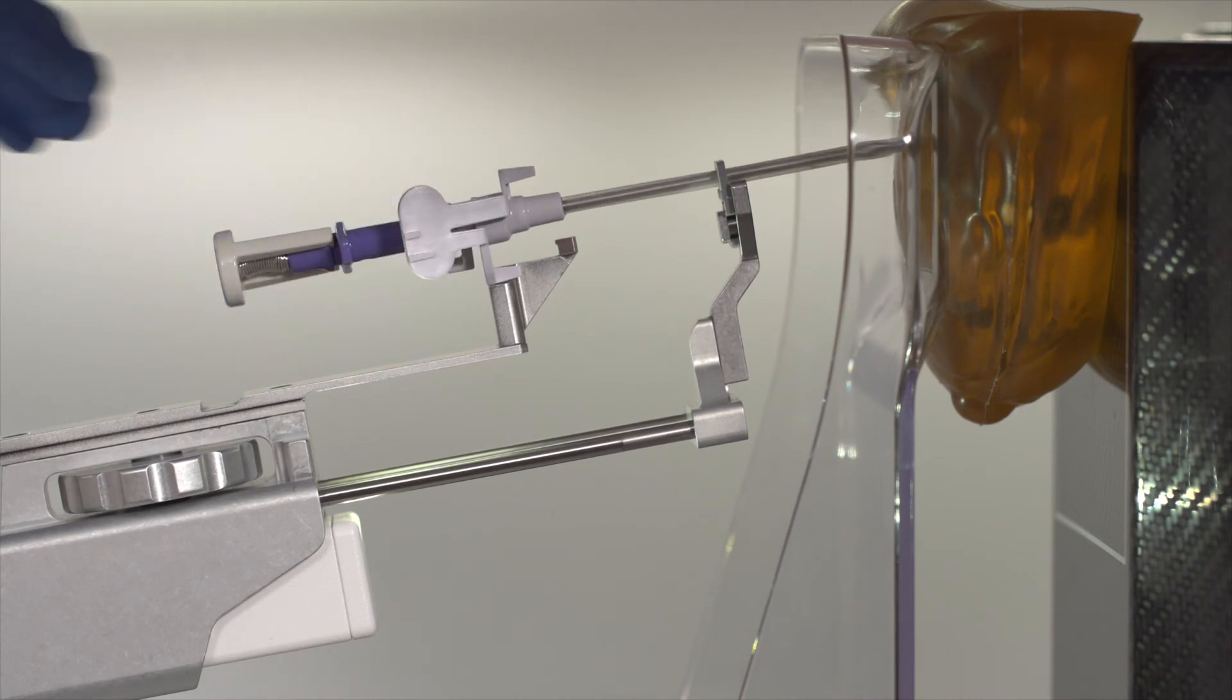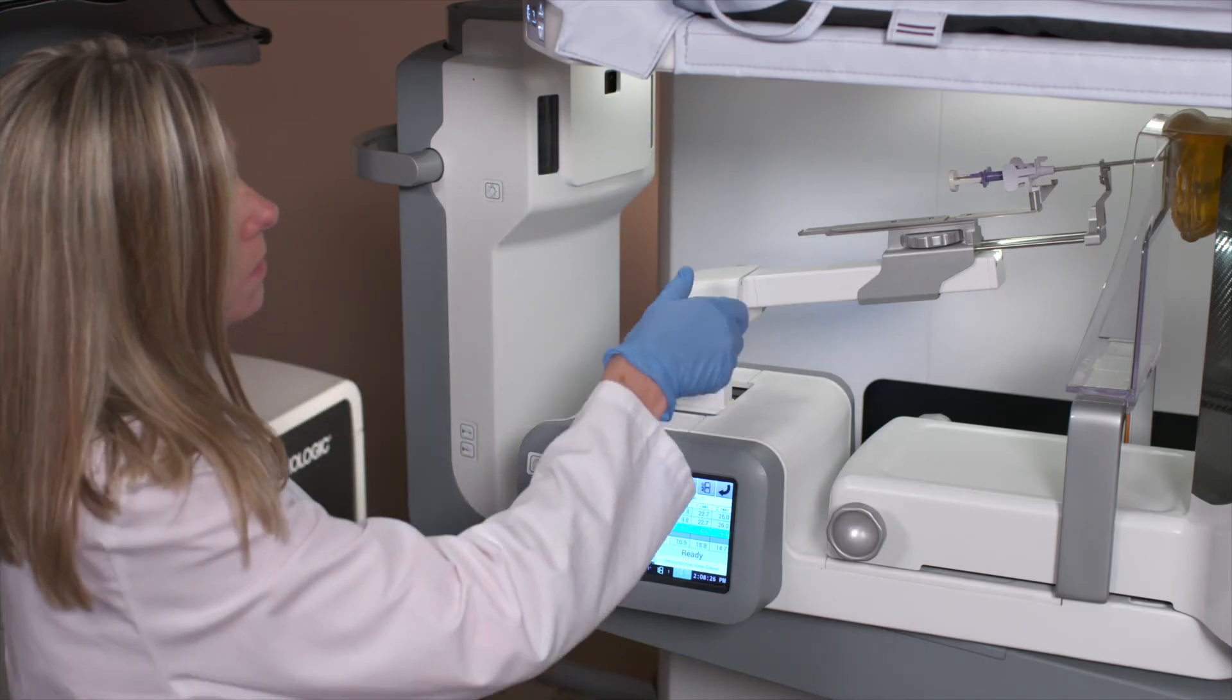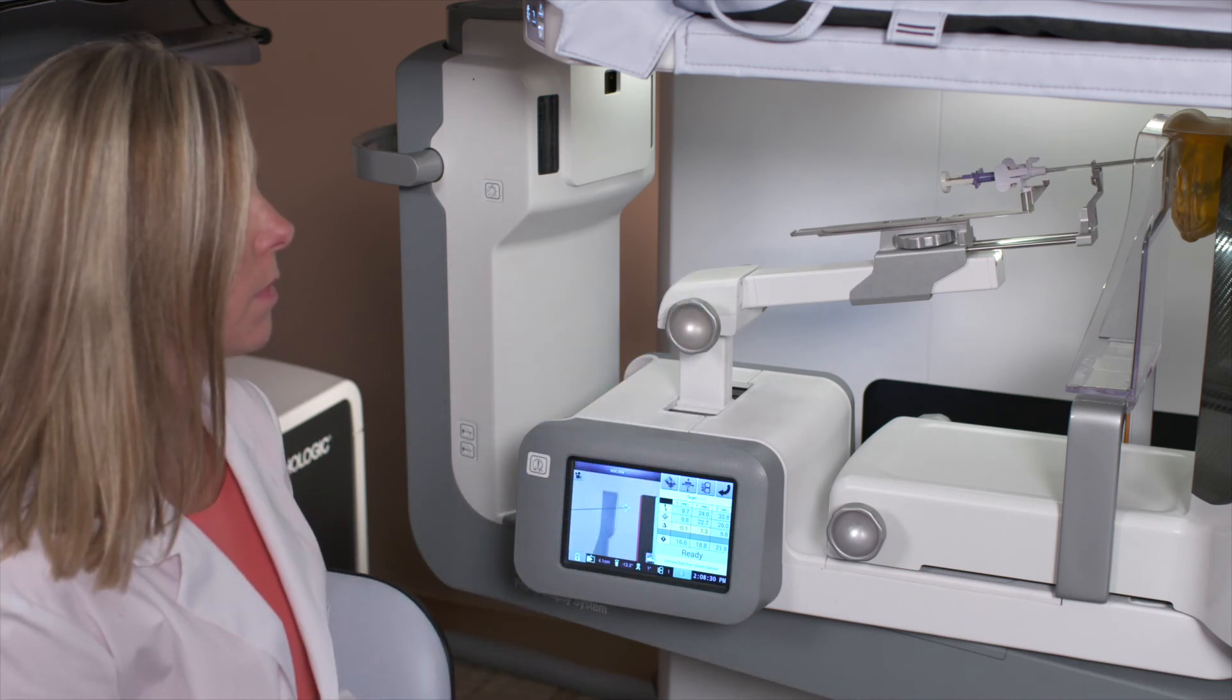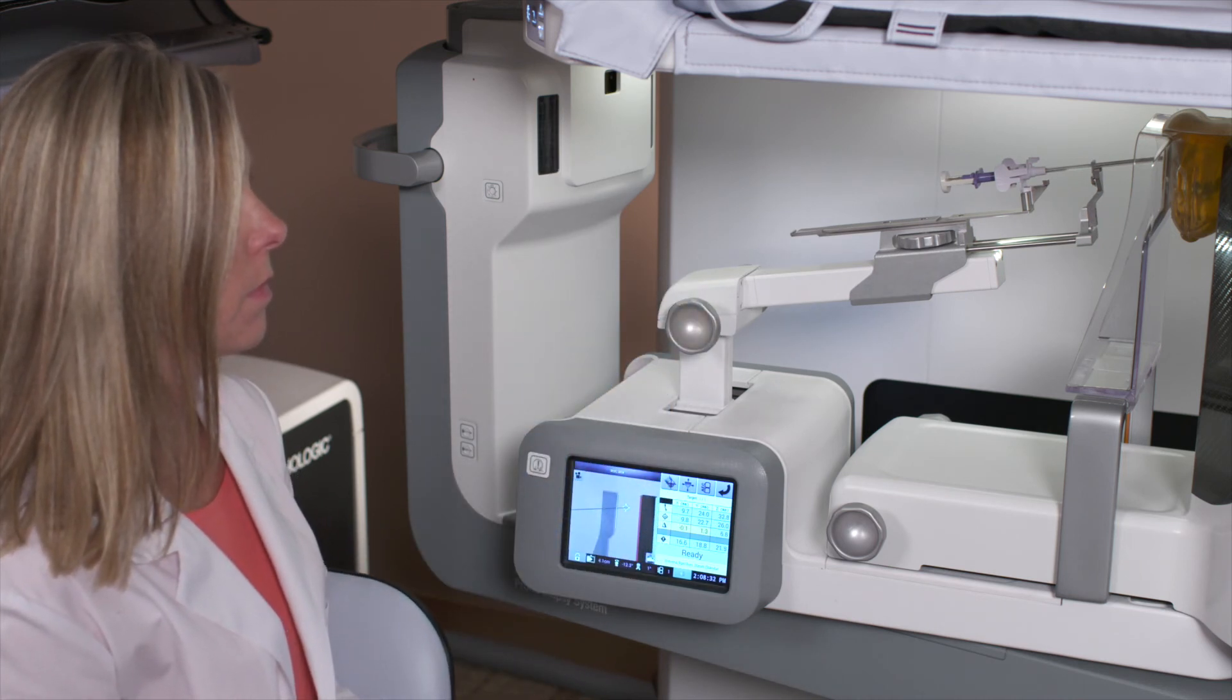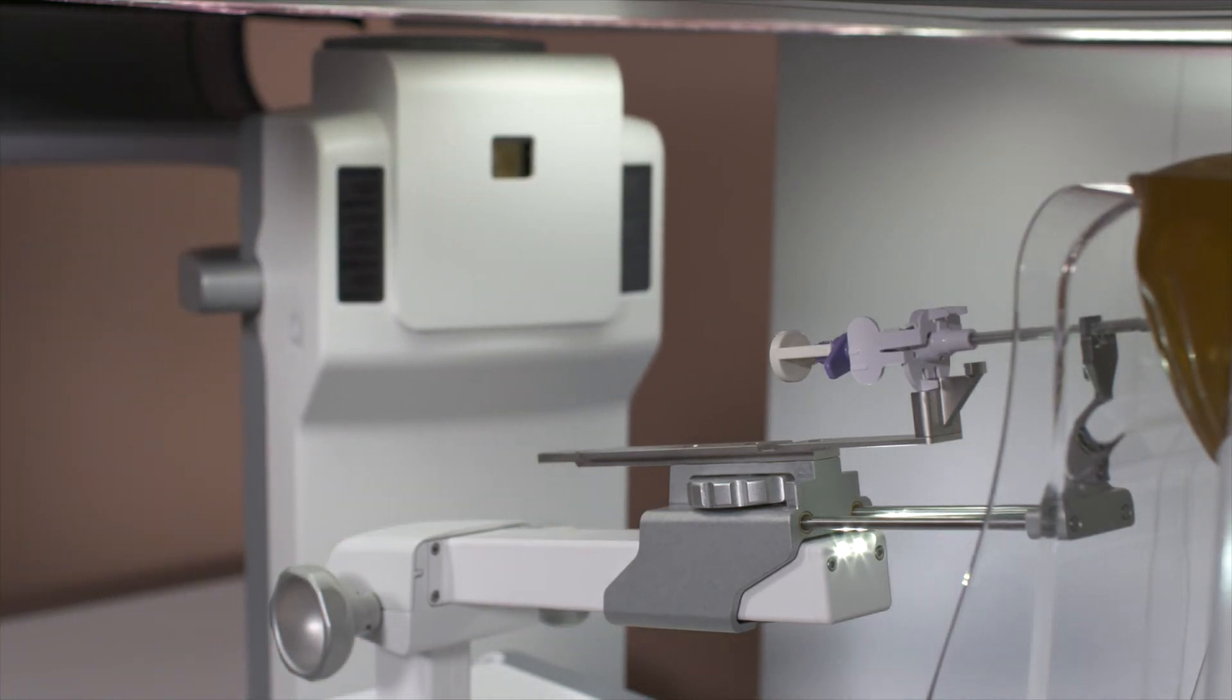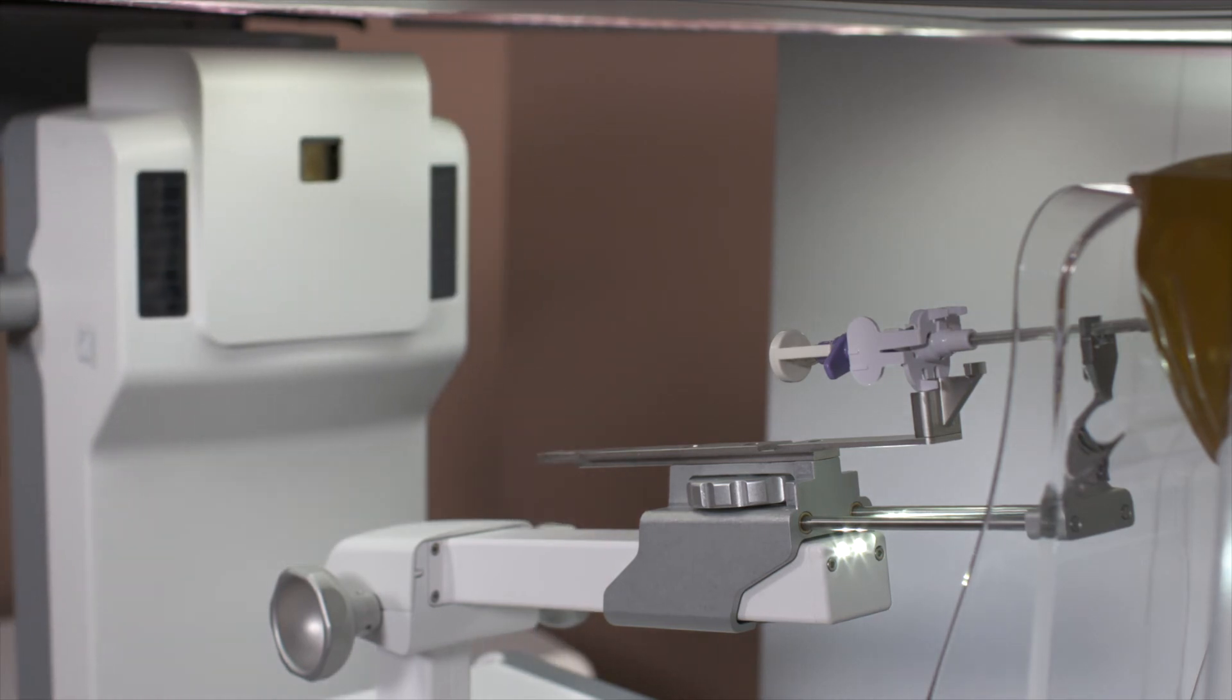Then, the physician may back the system out slightly to ensure the tip of the marker deployment system is out of the field of view. The technologist will then take a final image showing that the marker was successfully deployed in the correct location.